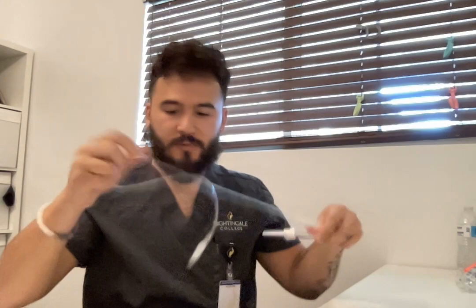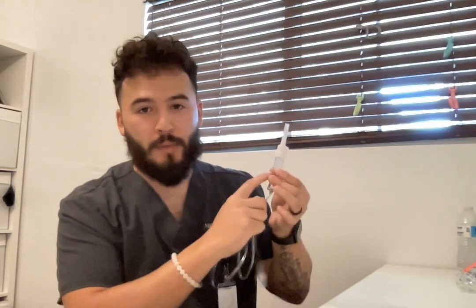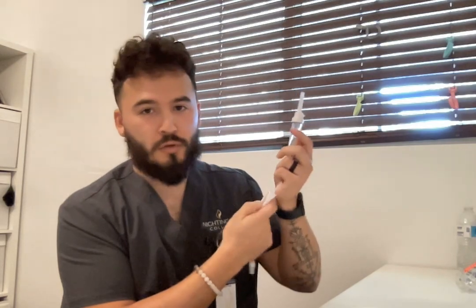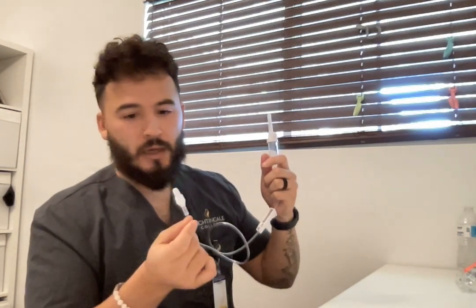And then now the same concept for the secondary line: we have the spike, keep it sterile. We have our drip chamber, fill it up halfway. Same concept. We have the roller clamp, roll it higher for more flow, down for fully clamped. The only difference is our adapter. This adapter will go into the Y port. So we have that. Now we have our fluid bag, and then our medication bag. I have them upside down because I already removed the caps, just because they're a little hard to take out.